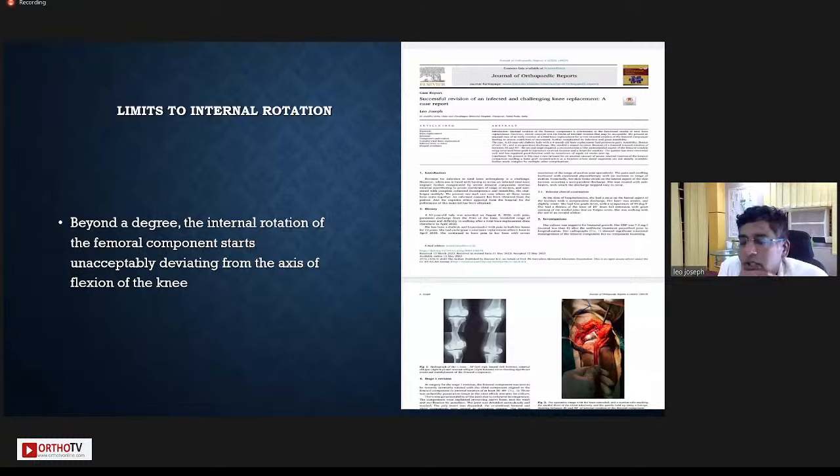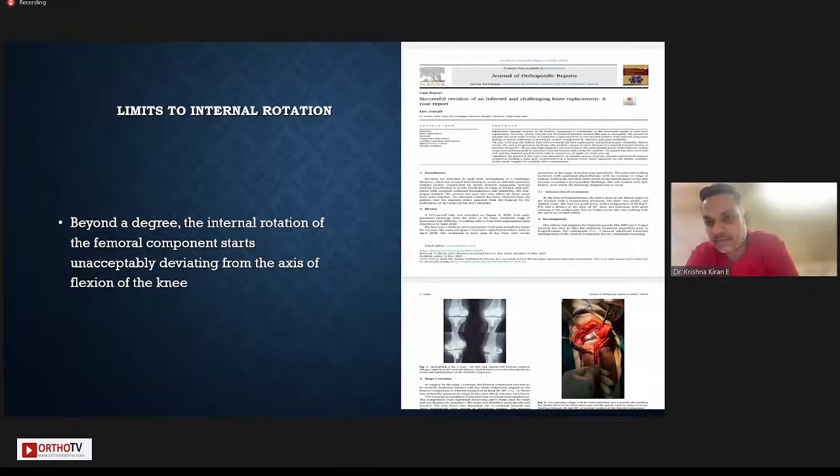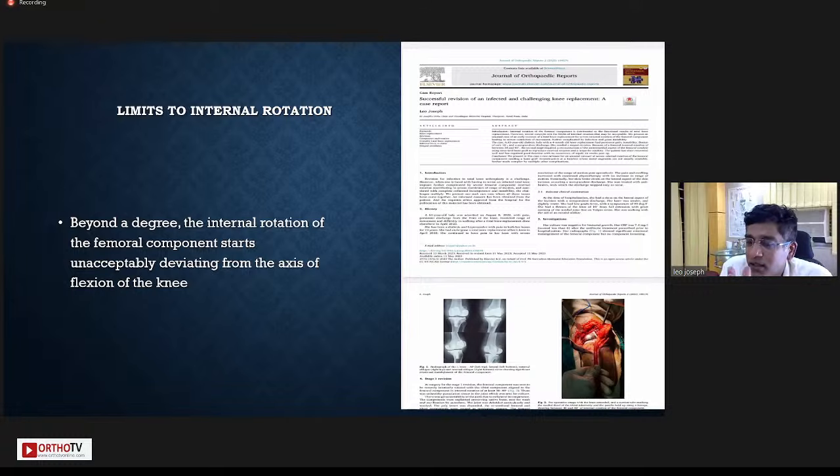If I can ask you something, Kiran, basically we don't really have evidence to suggest that a knee put in varus performs badly, provided the ligaments are balanced, or any better than a knee put in 0, 0, -3, and vice versa. A well-balanced knee put in 0, 0, -3 doesn't perform any inferior to one put in a functional alignment or in a varus position as well.